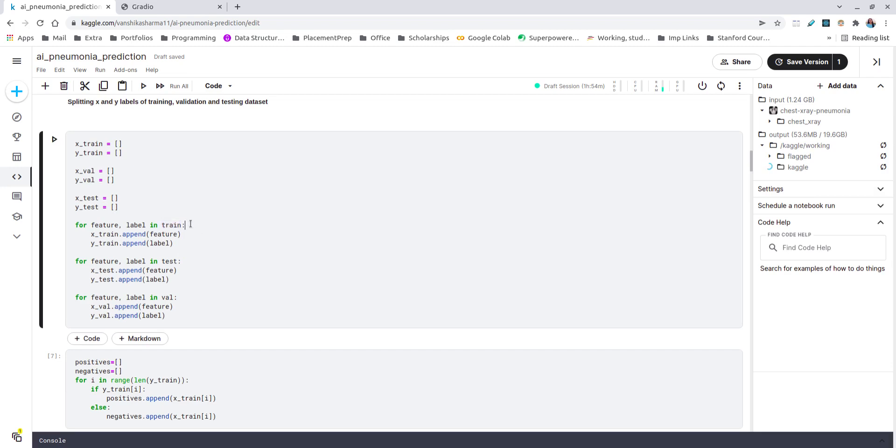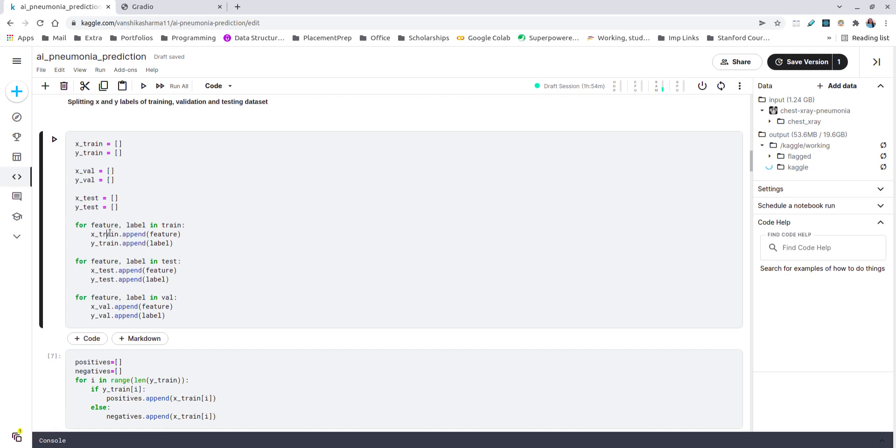Every variable train, test, and validate contains two variables on two indices: first is feature and another is label. I'm appending the features in the X variables—X_train, X_test, and X_validation—and labels are in the Y part. Here in my data, the features are the images. As we all know, when we try to work on images they are stored as matrices. Colored and black-and-white matrices are stored, and labels are pretty much very simple: zero and one, zero for normal and one for pneumonia.